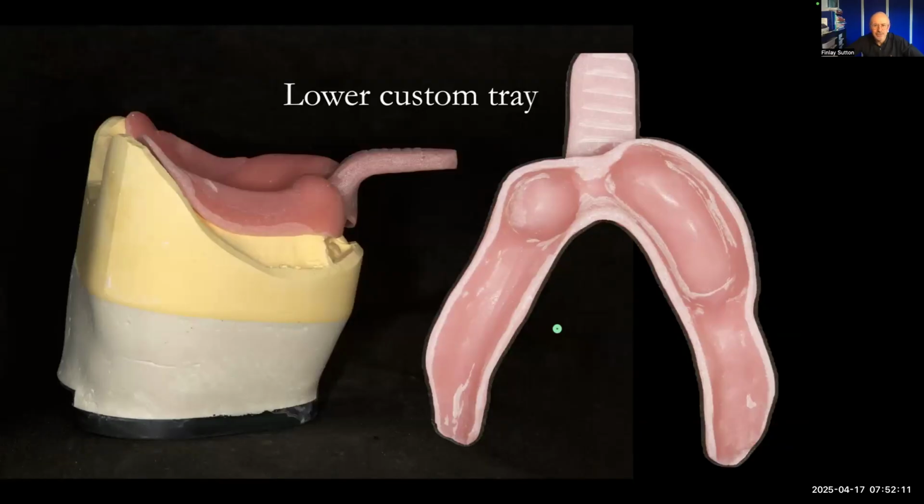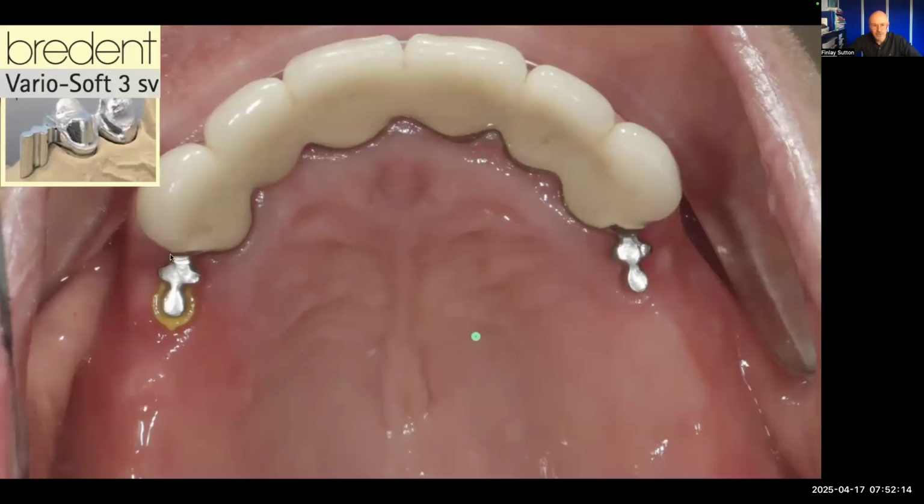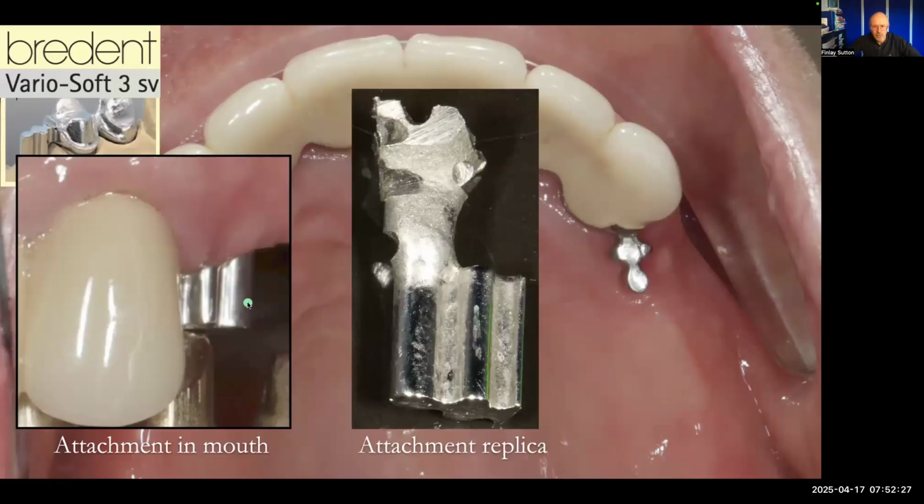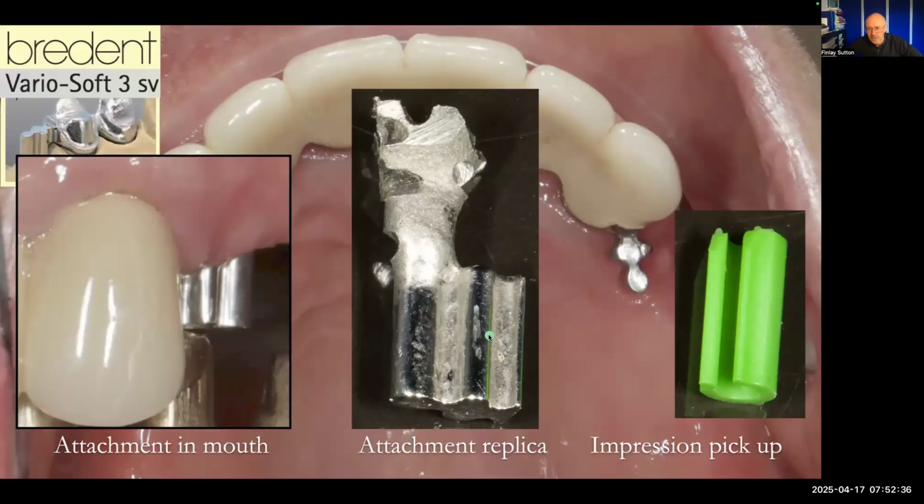And then we'd done our research, so we'd found out that these attachments were Bredent Variosoft 3. And so that's the attachment in the mouth. And Chris got a wax pattern of this shape and then cast it up in chrome. So he produced an attachment replica, and we got an impression pickup from Bredent that would just slot onto that. So I could then do an impression of that in the mouth. We could then fit that into the impression and then cast up the model and have metal patrices on the model. I'll just show you what I mean by that.